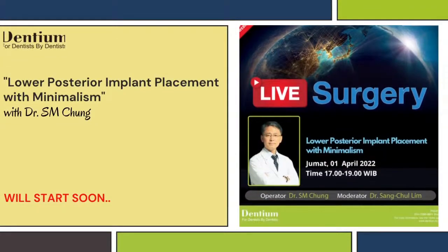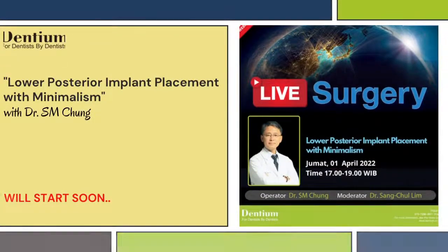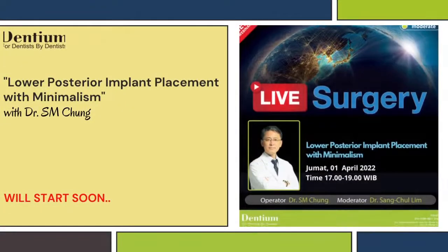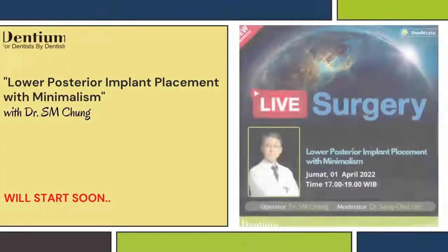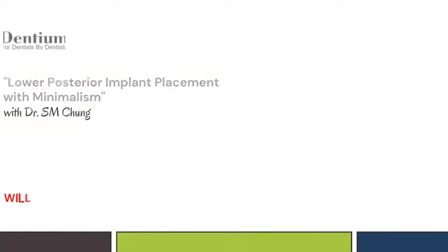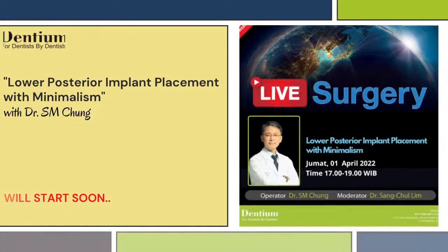So today's surgery plan looks like this, from the Bright implant system. First guide drill insertion, then the final drilling, and then final fixture installation with the NTI tissue level implant fixture. After insertion, the ordinary connection with the scan comfort cap looks like here.